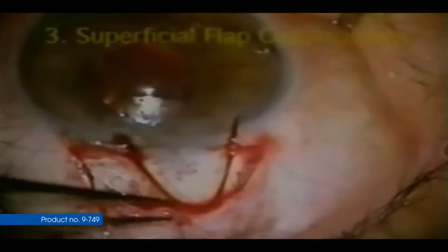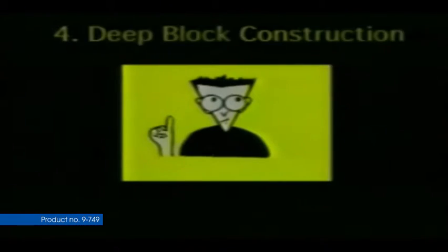To assure a good superficial flap, use the parabolic marker and cut slightly deeper than the needed depth. Start at the apex, judge 200 to 250 microns, and use a Greasehaber mini diamond knife. Then switch to the Greasehaber mini spoon blade — bevel down, hands low, and don't tent up the leading edge of the flap.